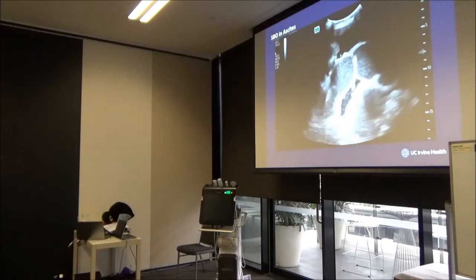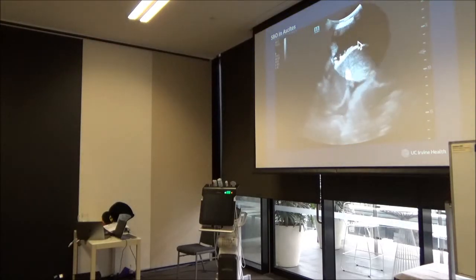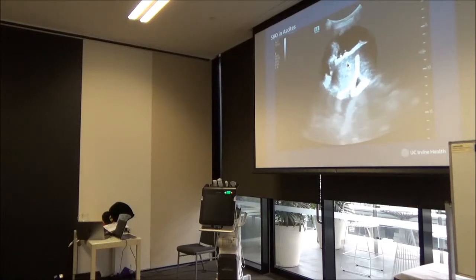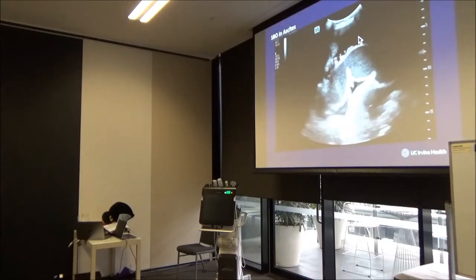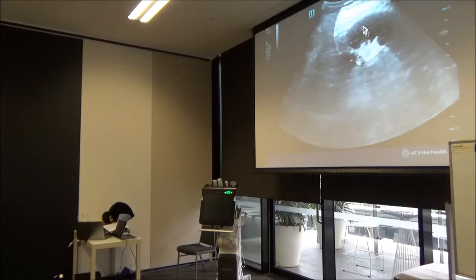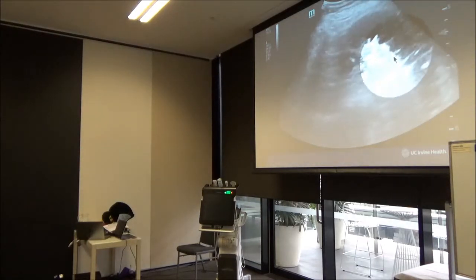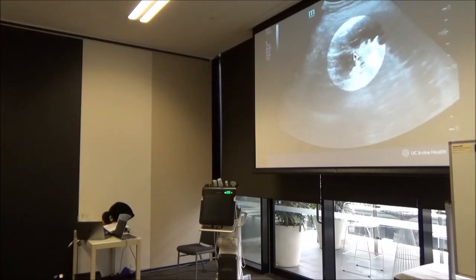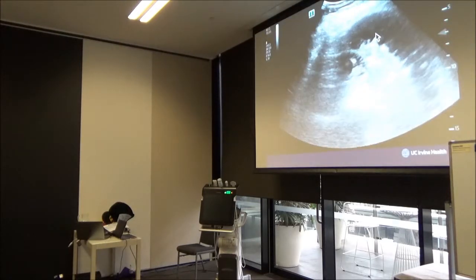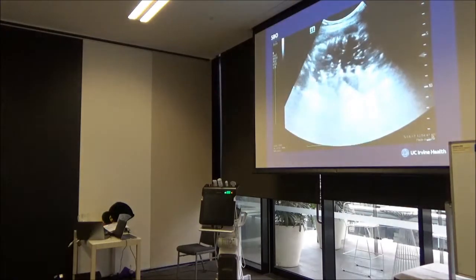This patient has a bunch of ascites up here adjacent to their small bowel obstruction. You can see these loops of bowel floating within the ascites. Another example here, again, all the keyboard sign of the plicae coming around here, distended loop of bowel here, with the fluid-filled loop of bowel. Another example.